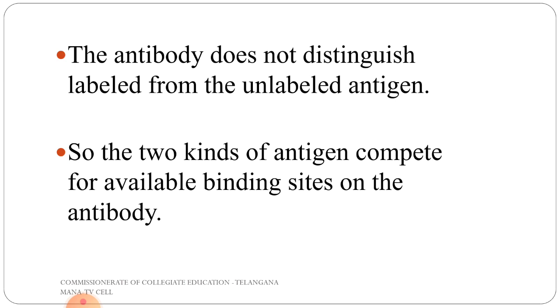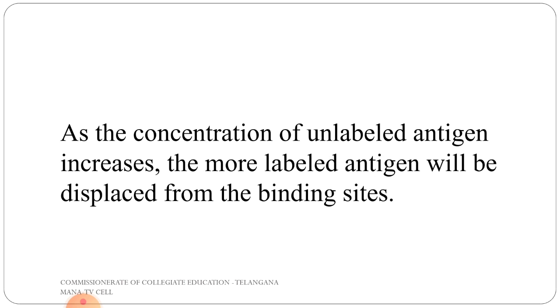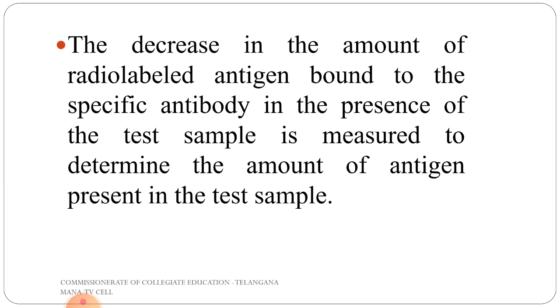The antibody does not distinguish labeled from the unlabeled antigen. So, the two kinds of antigen compete for available binding sites on the antibody. As the concentration of the unlabeled antigen increases, more labeled antigen will be displaced from the binding sites.